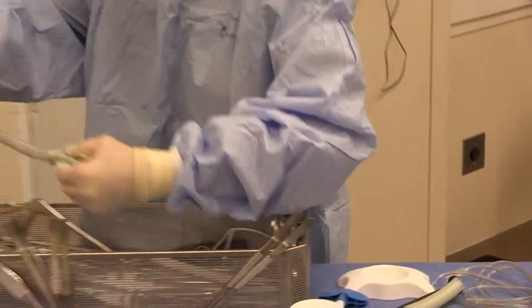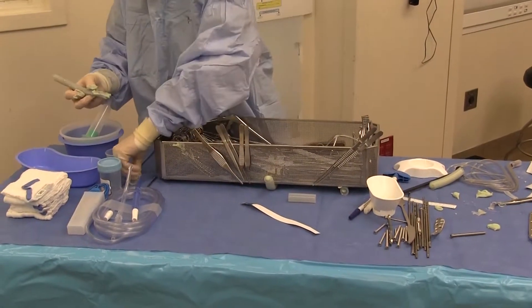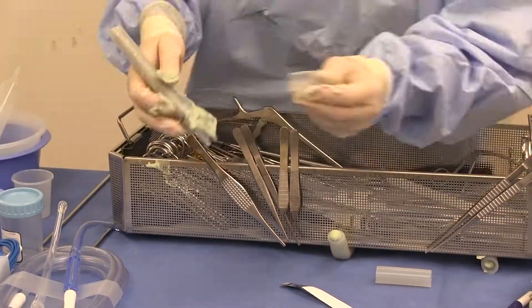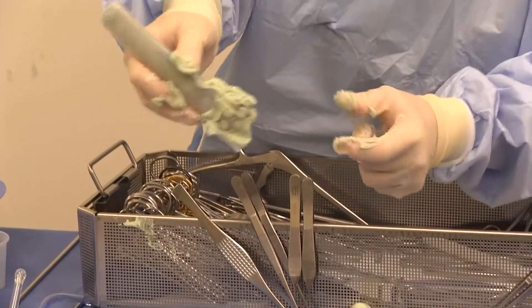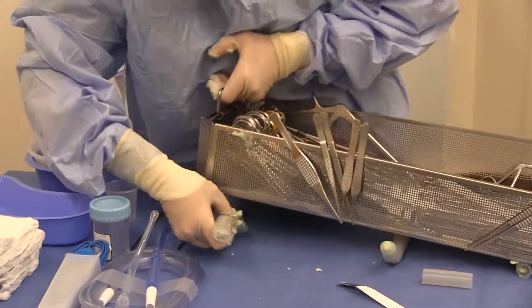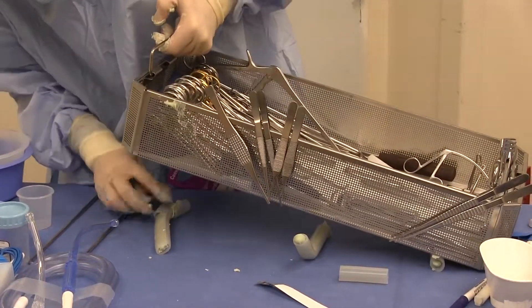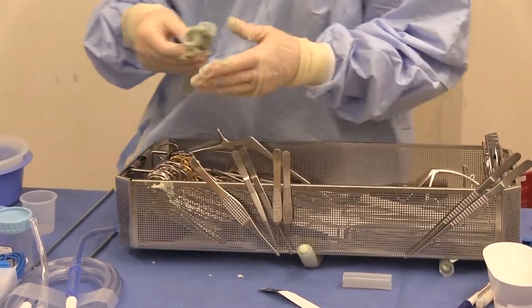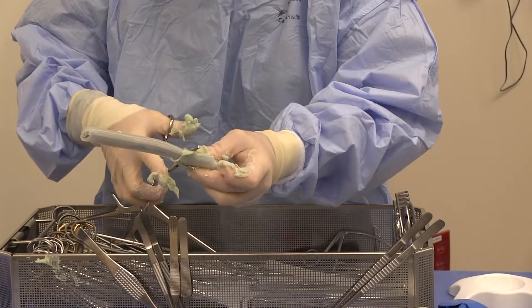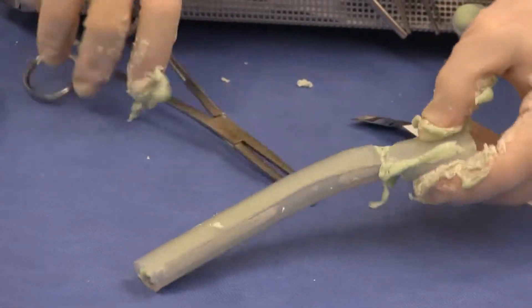Sticking this underneath and waiting for it to get a little bit doughy. I still have a really nice coating there, even if it's not 100% perfect. You can see where I'm getting some good coating on this plate. I'm going to put this underneath my tray, like I did the other plates. It's not awesome, but it will get the job done.